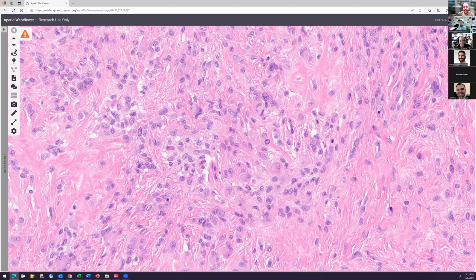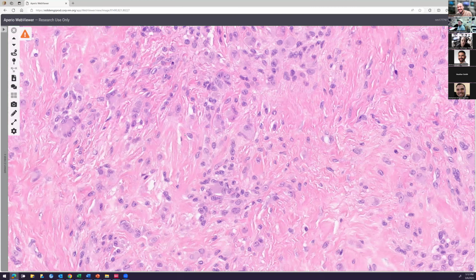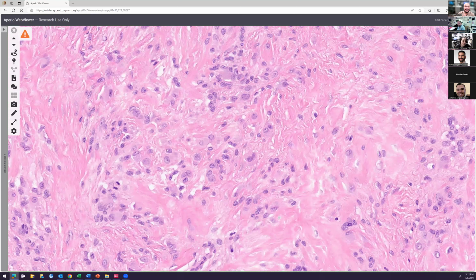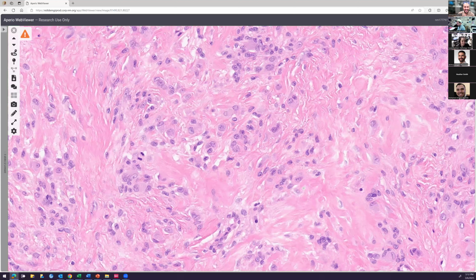Yeah, I'd call it inconspicuous. My favorite word. They're inconspicuous, they're there, but they're not like melanoma, they're not huge. Nucleoli are pretty typical in a lot of cells, including histiocytes, where you'll often see a little nucleolus here and there. And that's okay.